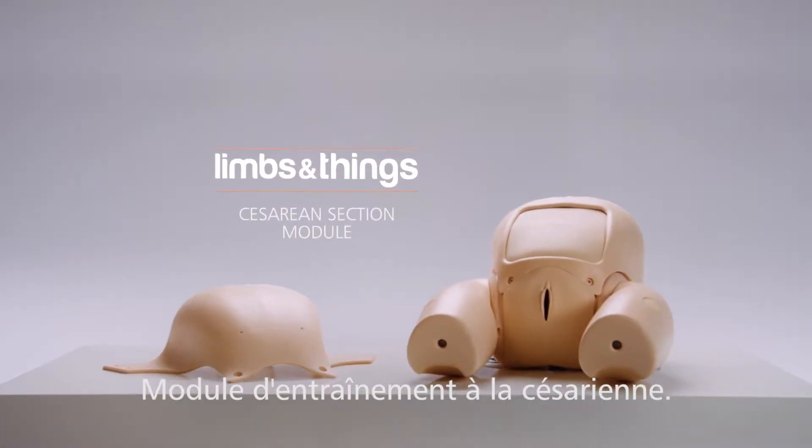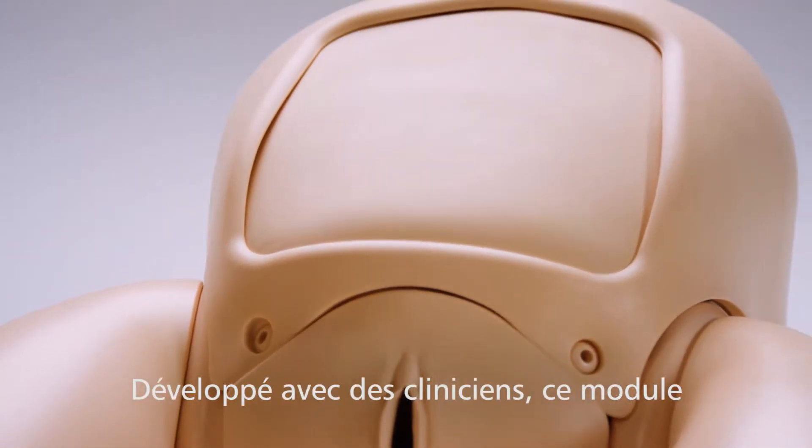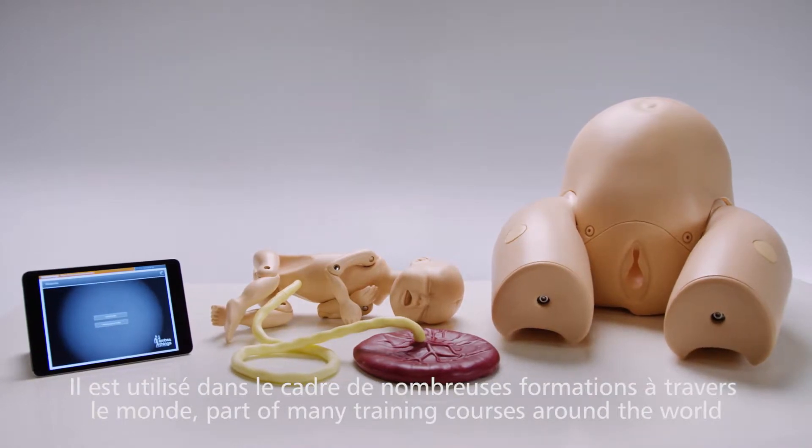This is the Limbs and Things Cesarean Section Module. Developed with clinicians and part of the Prompt Flex range, it has become integral to many training courses around the world.